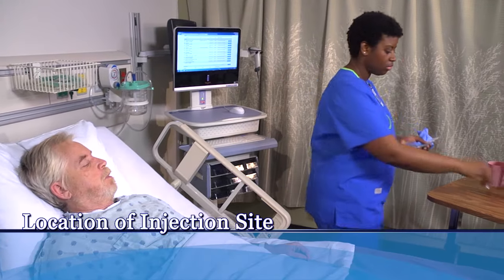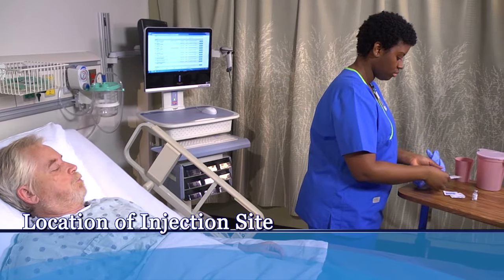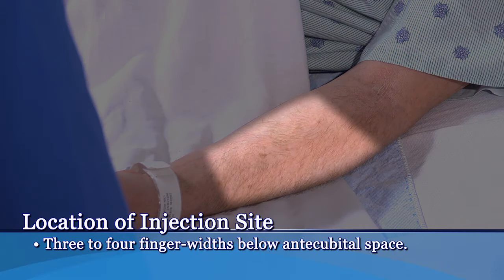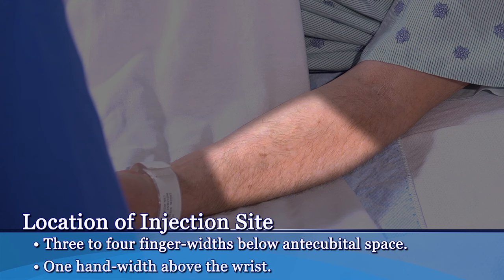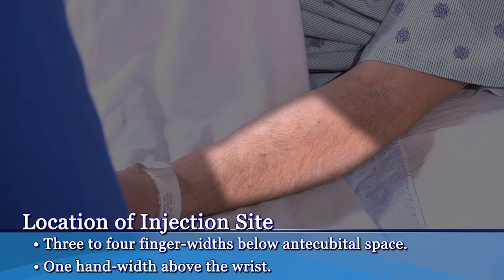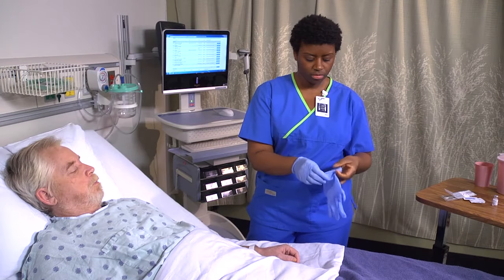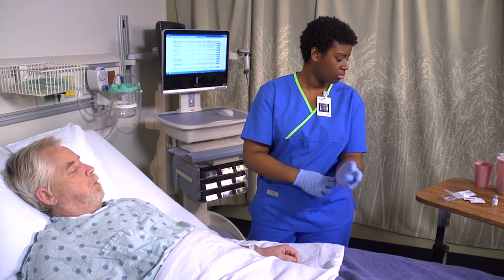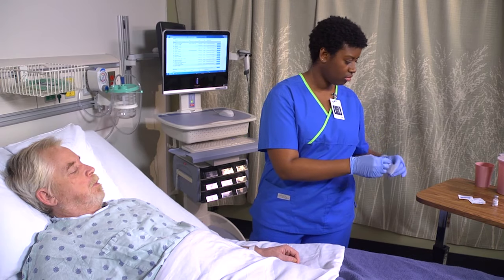Choose an injection site free of lesions and discoloration. Select a site three to four finger widths below the antecubital space and one hand width above the wrist. If you can't use the patient's forearm, inspect his upper back. If necessary, use a site that would be appropriate for a subcutaneous injection.